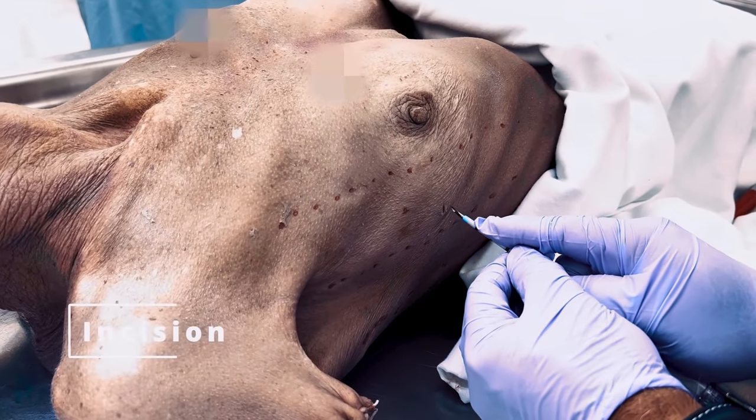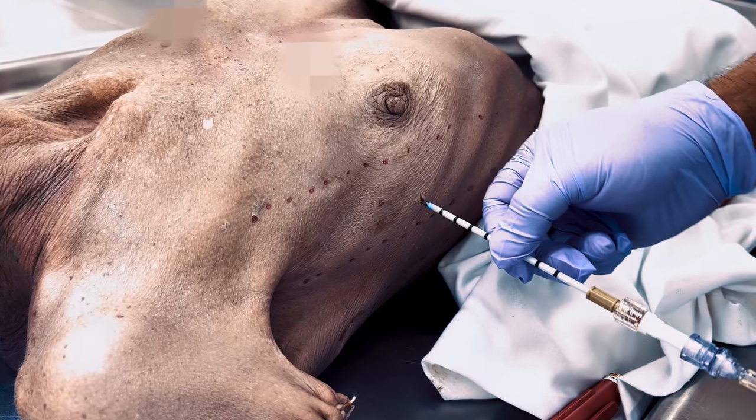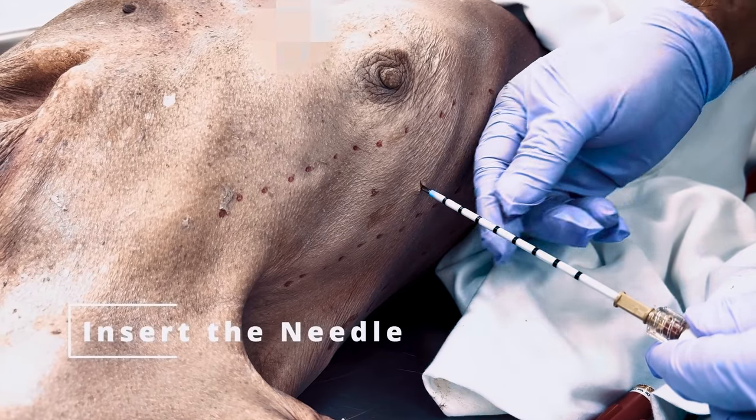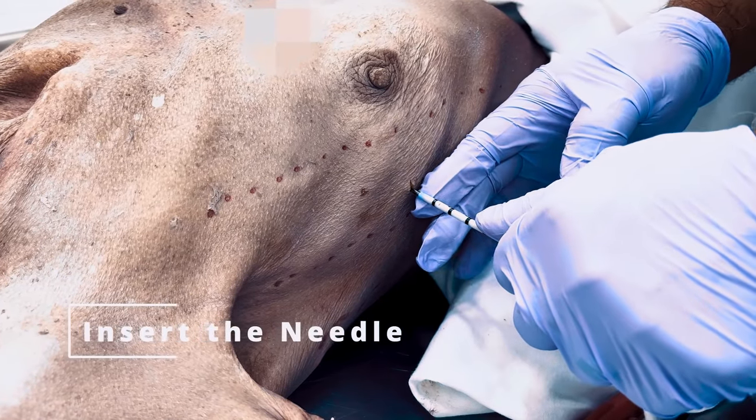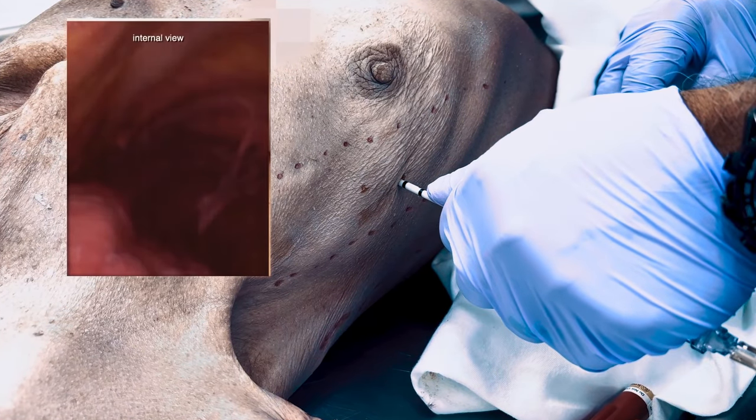Using the scalpel tip of the spear needle, make a 0.5 centimeter incision in the skin at the insertion site. Insert the needle into the skin and adipose tissue until contact is made with the rib. Then measure and hold the needle at three centimeters above the skin.